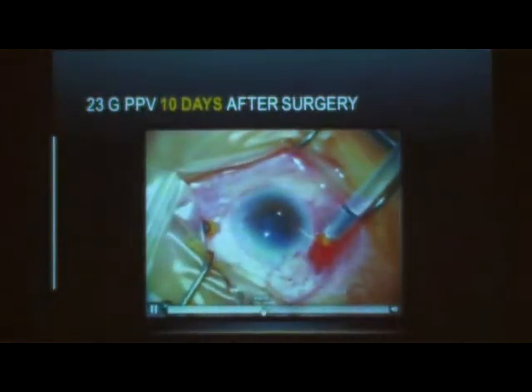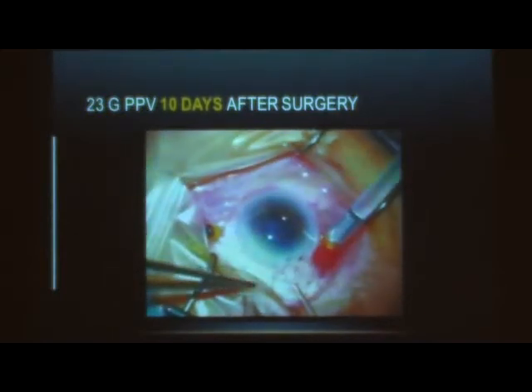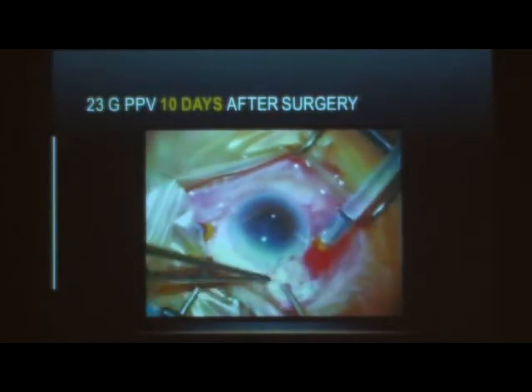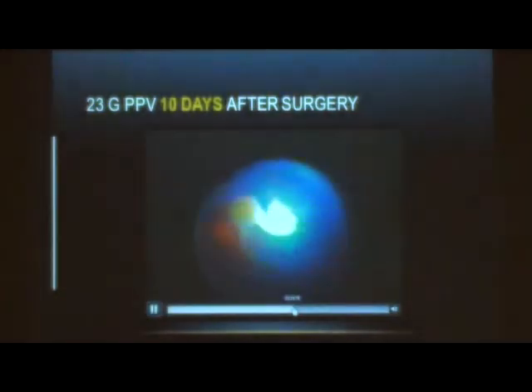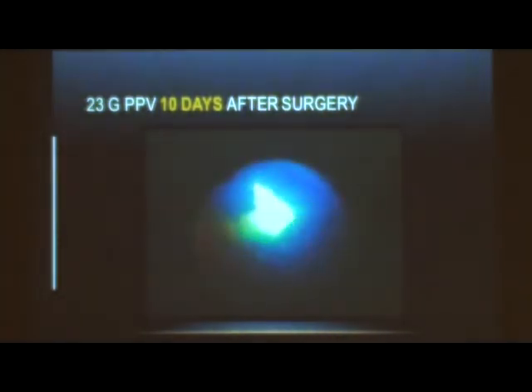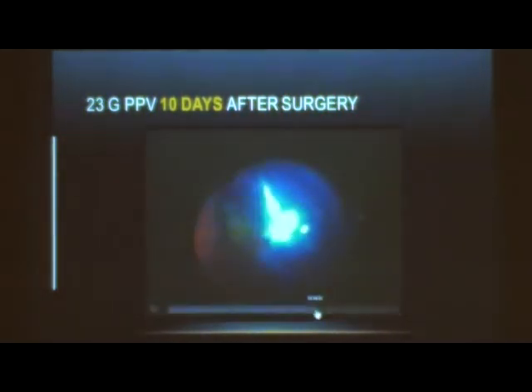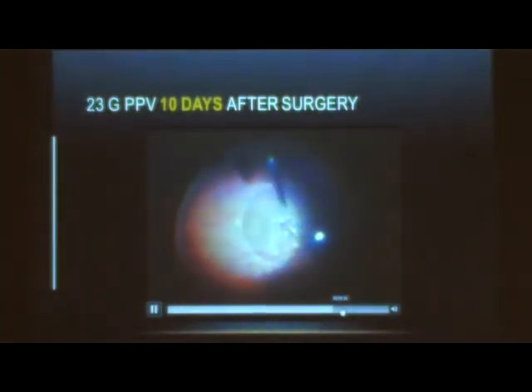So again, you remove one of the cannulas. You don't have to really open the conjunctiva or do a peritomy. You can just use a 20-gauge MVR to enlarge your entry site. Okay, and then you can use the Phaco fragmatome. Of course, you don't use the Phaco fragmatome until you do a proper vitrectomy. You don't want to engage the vitreous with the Phaco fragmatome because this can induce retinal breaks. And you aspirate and you work in the mid-vitreous away from the retina until you can completely divide and completely remove the whole nucleus.